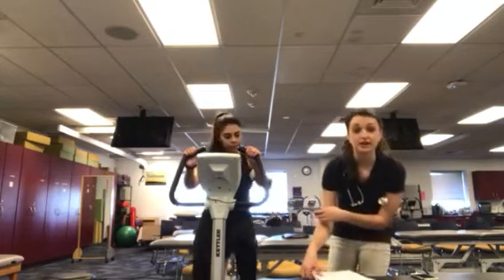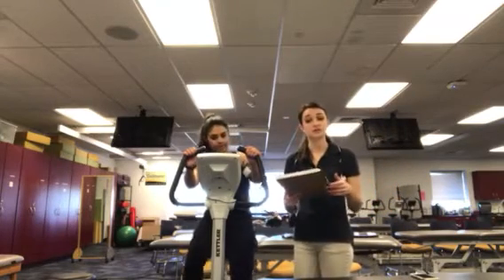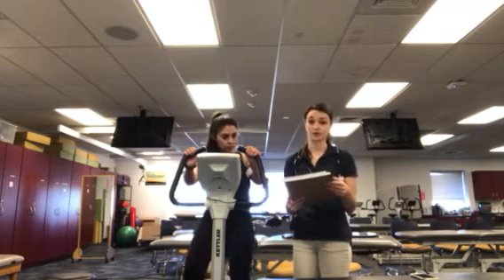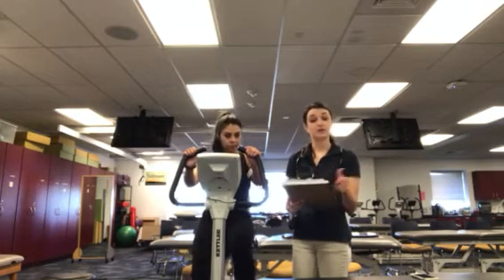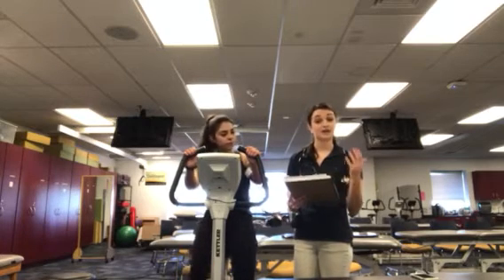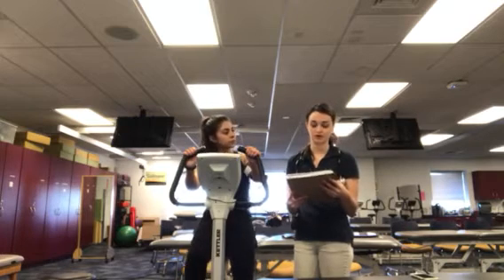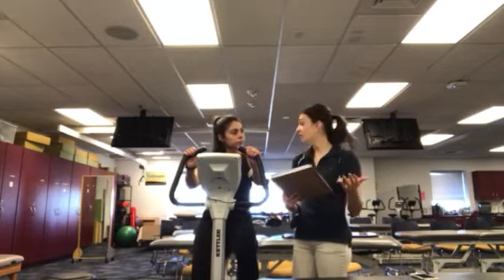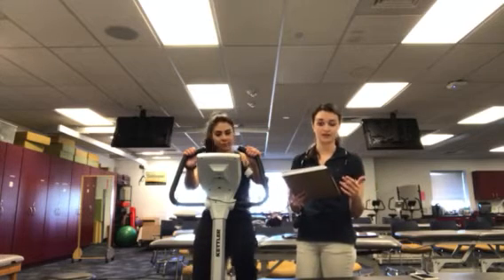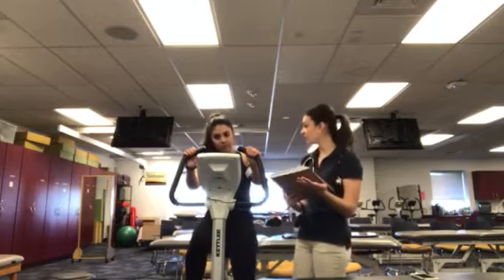So Brooke's values that I just recorded for that last portion of the test: she was at 152 beats per minute for her first heart rate. Her blood pressure was 142/74 millimeters of mercury. Her RPE was a 12, and her second heart rate was 155 beats per minute. Again, we are at steady state since Brooke's heart rate was within 5 beats per minute for both of the heart rate measures. So now we have been in 2 consecutive states where our heart rate has been in steady state, and we are within that submaximum range for her heart rate, so we can conclude the test.